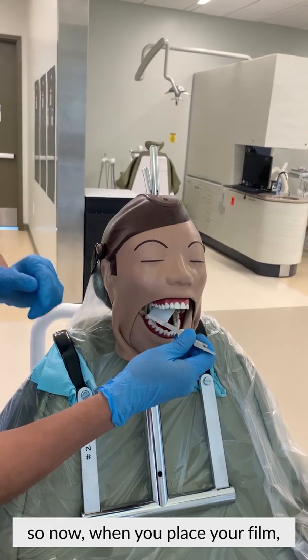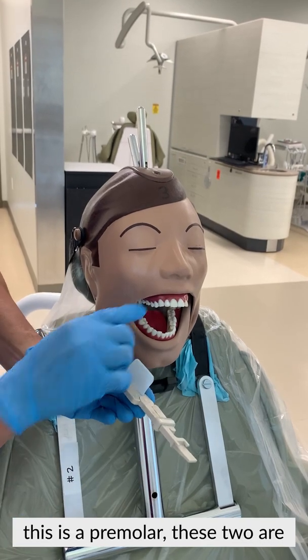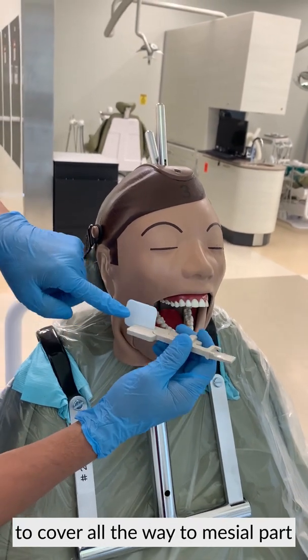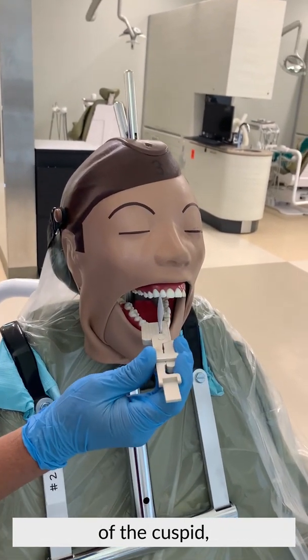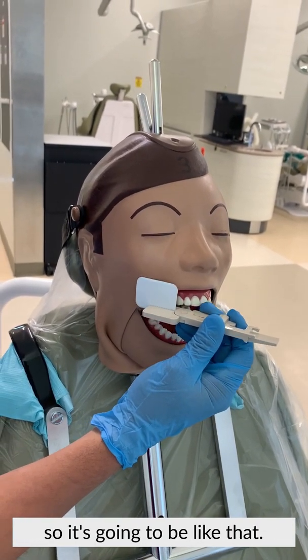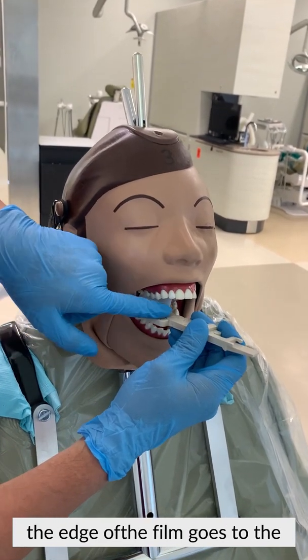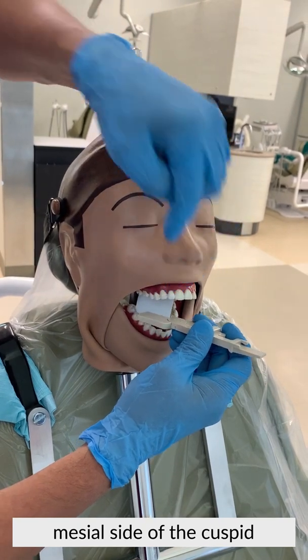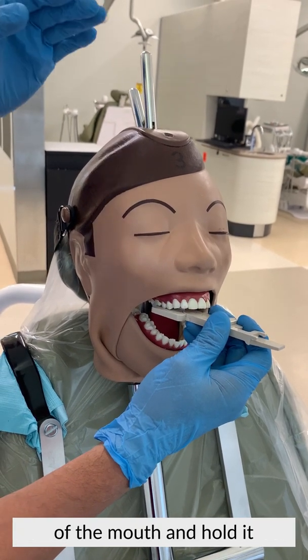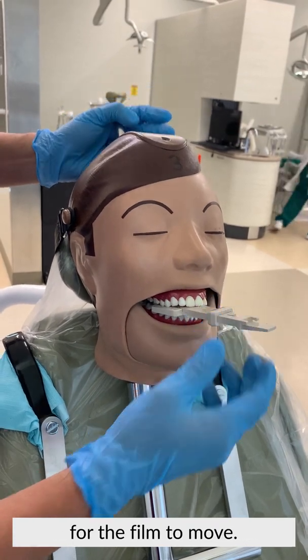Okay, so now, when you place a film, you have to make sure that the edge of the film, since this is a premolar, these two are your premolars and that's your cuspid. The edge of the film is going to cover all the way to the mesial part of the cuspid. So I'm going to place it outside so you know what it means when it goes inside. So it's going to be like that. So when you go inside, the edge of the film goes to the mesial side of the cuspid, which is right there. Now another tip, push your film up against the roof of the mouth and hold it there. So when the patient bites down, there is less chance for the film to move.